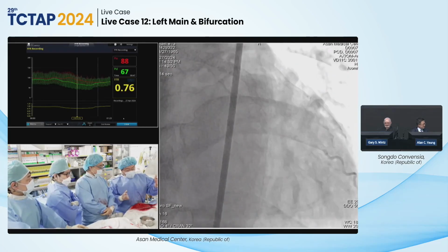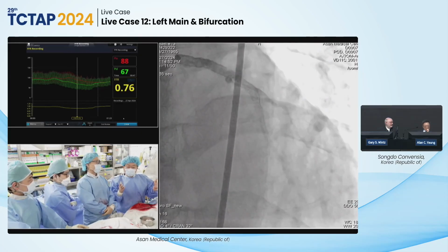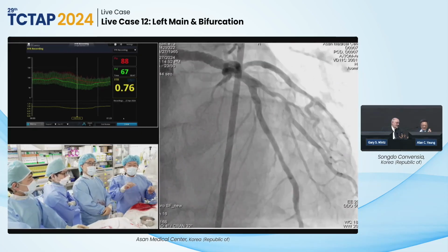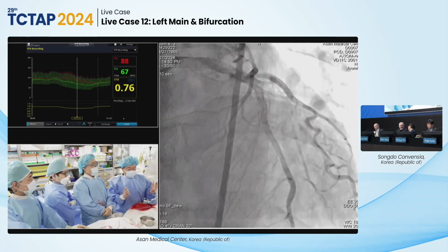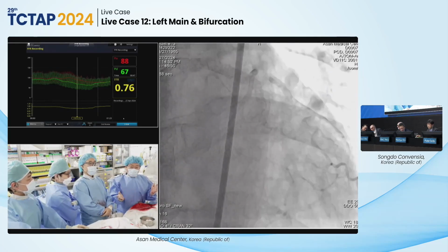The point is, we believe in the range between 0.8 and 0.75, you may remember that Jongpil made some data initially with a 0.75 cutoff value, and so we analyzed a kind of gray zone between 0.8 and 0.75.